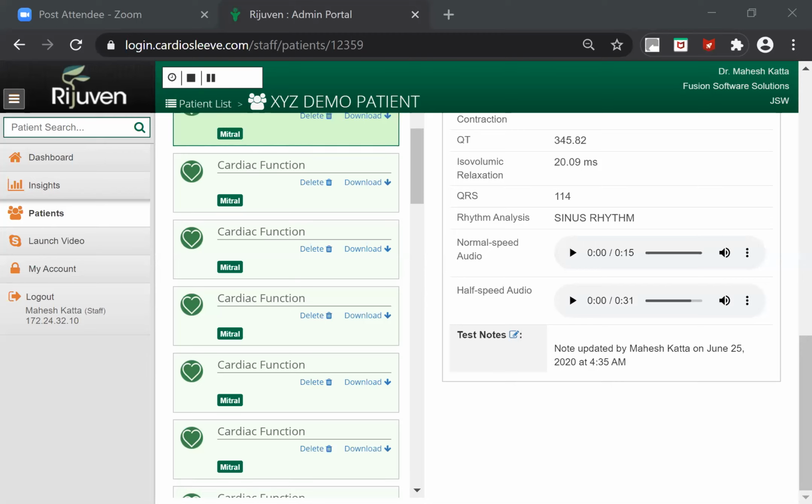The first one is vitals. You will see the vitals risk index here. Okay, the patient has everything in green except the blood glucose, which is a little bit high. So this is the first time the patient is tested, but if the patient has previous records, then that will be displayed here, so that the doctor can easily understand what their previous reports were in the past and what is the present report.